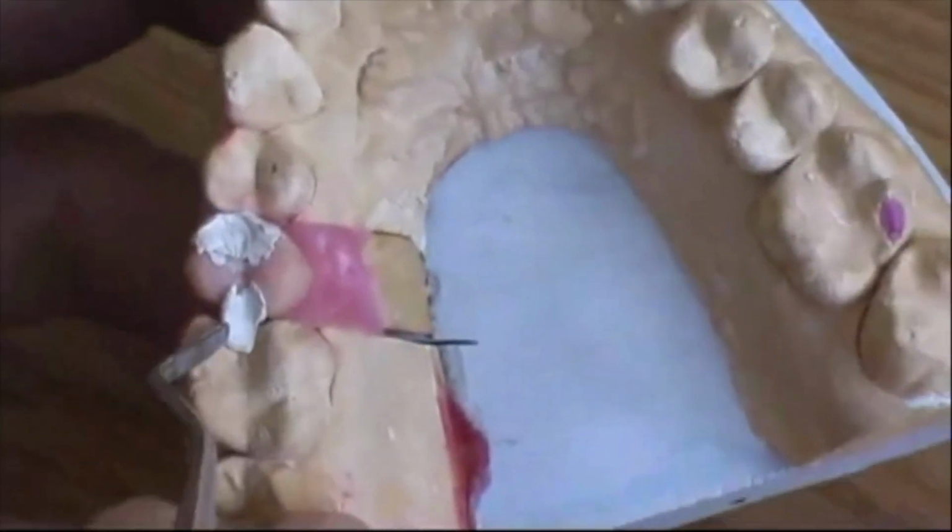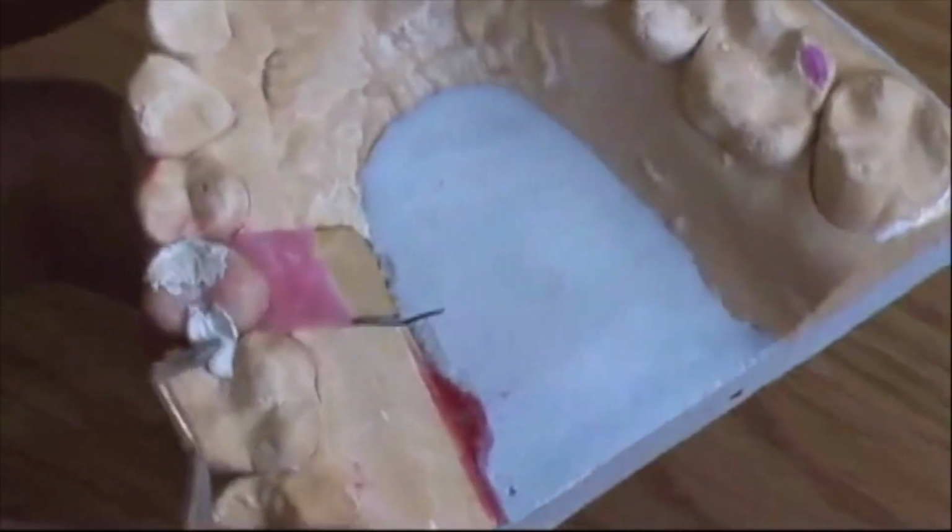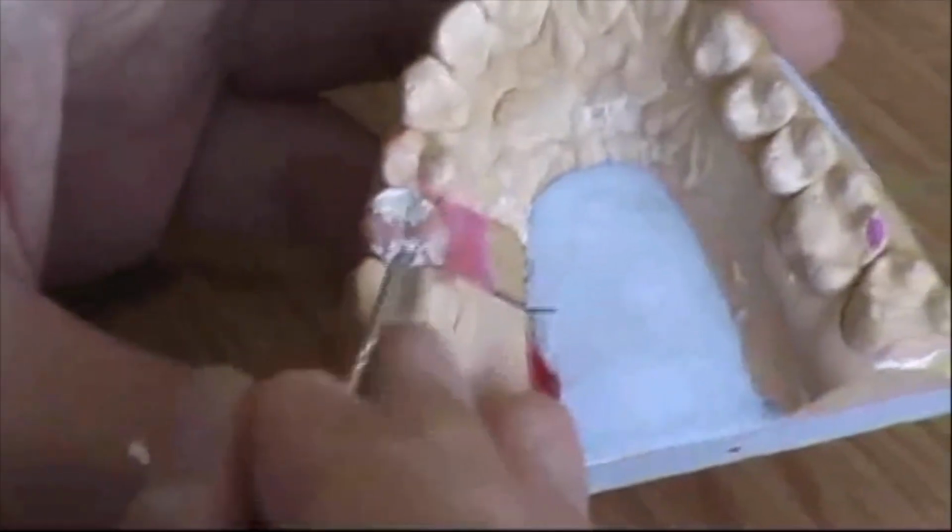patient's mouth. We can use this very cheap cement, or why not, we could use a composite. There's always some composite that is going to expire in your office. So it's not going to be expensive because anyhow you have to throw it away. It expires. You'll always have this. So we make the tooth look as much as possible as the initial shape of the patient's tooth, right?